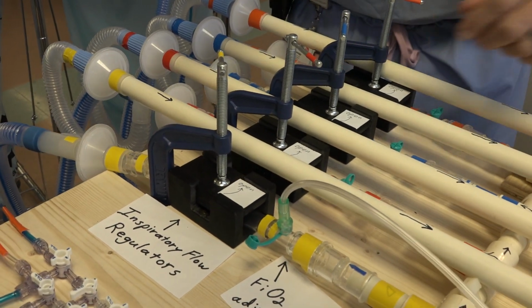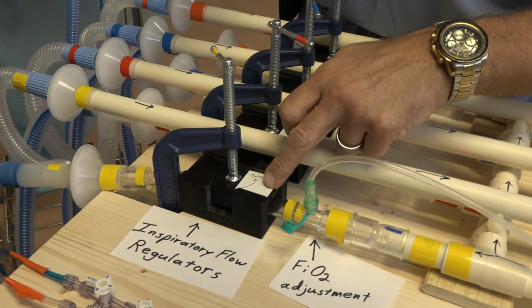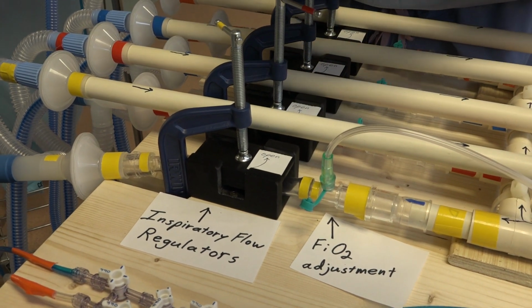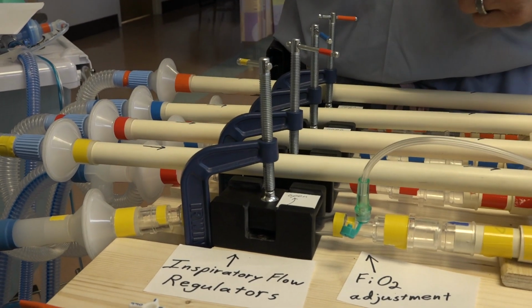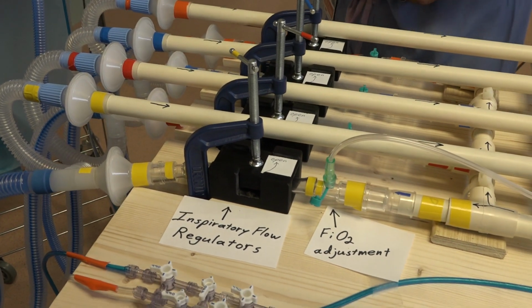We then used two blocks, one block on top and one on the bottom. This is just a fancy 3D printed version we used here, but you could use two blocks of wood or anything, and a standard C clamp here. By adjusting the C clamp, we can change our tidal volume and peak inspiratory pressure to each patient.